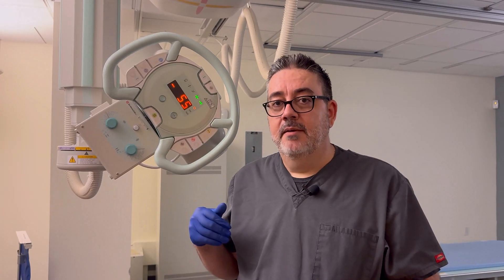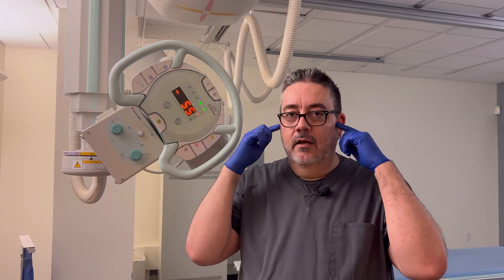We're still going to have the OML perpendicular to the image receptor. We're going to do this AP, and with TMJs, typically you do an open mouth and closed mouth view just to see the separation in the joint there, and you're looking for congruency.